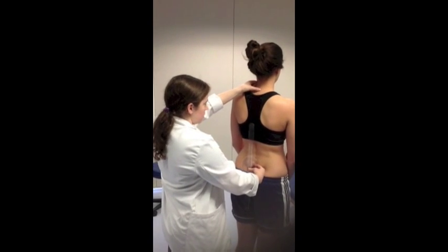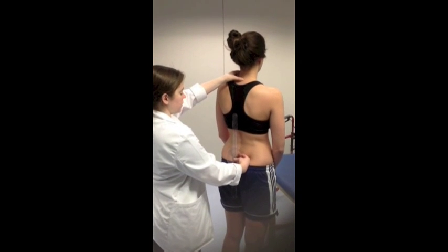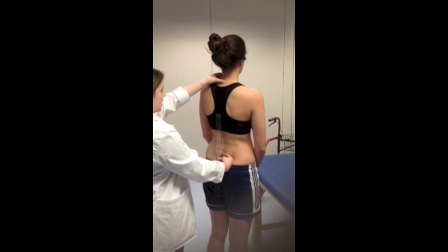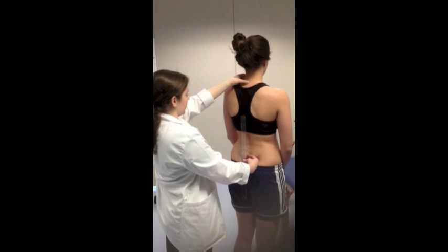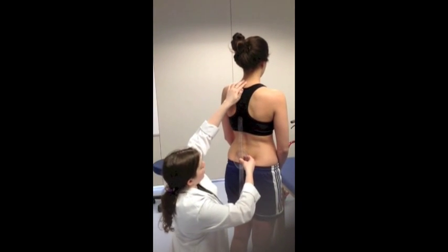So when I tell you to, you can bend over towards your right side, kind of reaching towards your right knee or the floor with that right hand, and keeping your shoulders in the same plane as if you're squished between two buildings and can't move forward or back. If you feel any pain, let me know and stop. Sound good? Sounds good. All right.